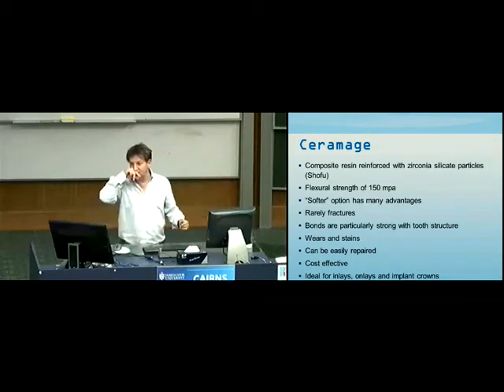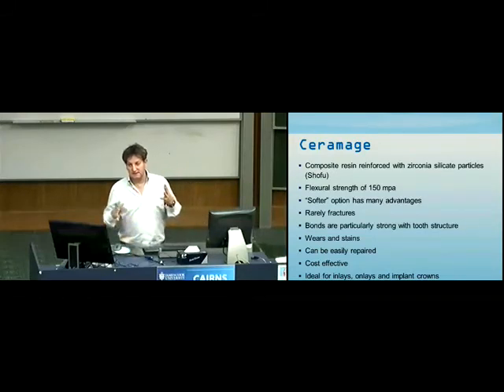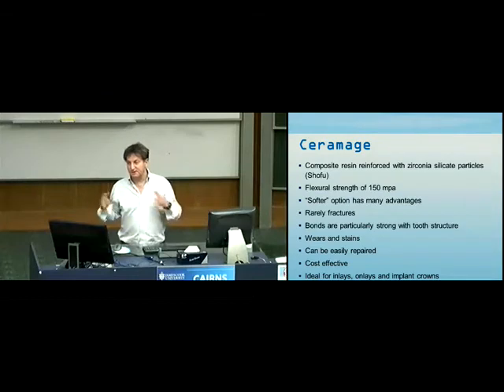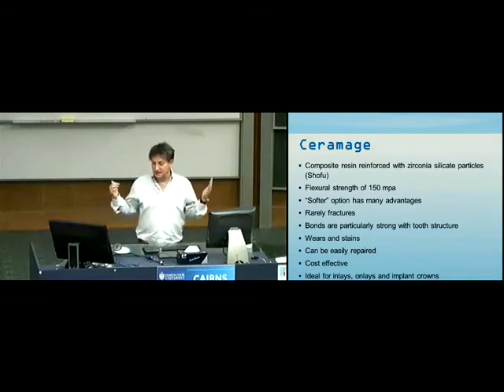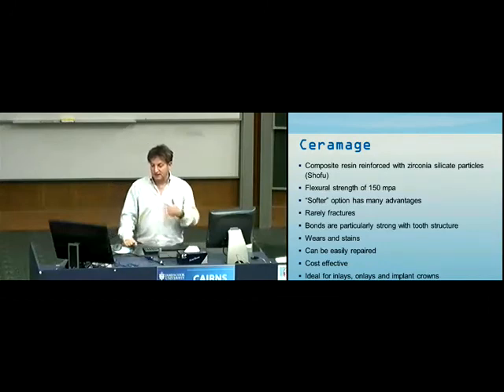He came in anyway and gave a really interesting talk. He talked a lot about dental materials and 3M's push into dentistry, obviously adhesives and abrasives are a big part of their business model, but he's very keen on dental materials. And they said their big push is towards soft. I thought that was very significant, because 3M are one of the biggest manufacturers of dental materials for crowns and inlays, and they're heading down that path. So we'll talk about the Lava Ultimate in a moment, but I think that they've got onto this idea that Shofu in the Japanese market have captured, and they said, going forward, we think we should be going softer.